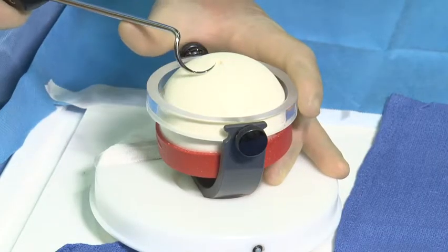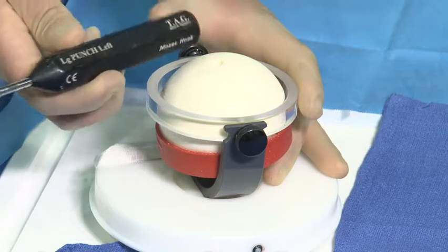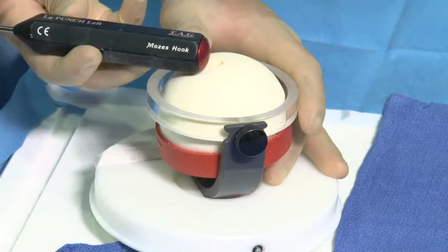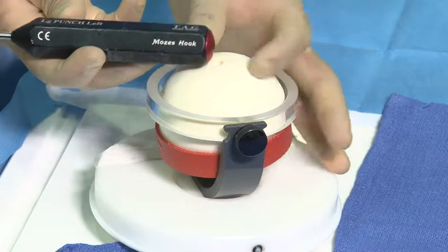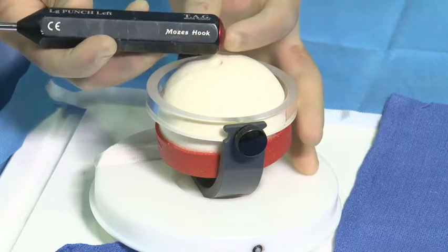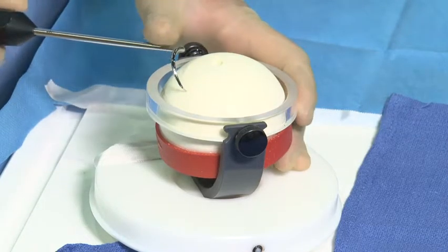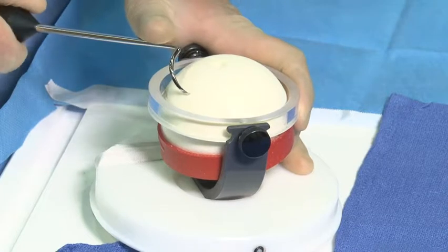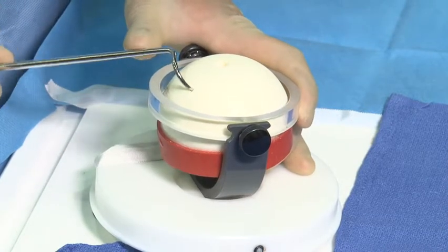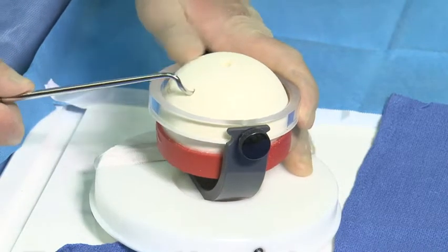As the Moses hook is utilized to create a tunnel in bone, the back handle of the device is not only color coded but is reinforced so that a mallet can be used to tap the device through the bone. We see in this saw bones model how the Moses hook is utilized to create a twisting motion and a passage through the bone.